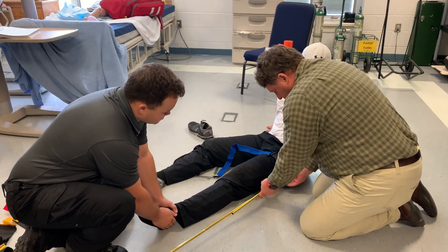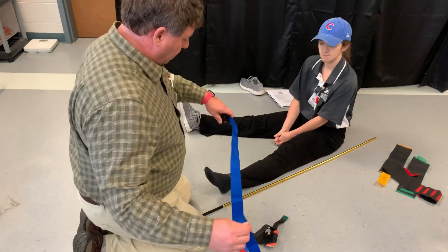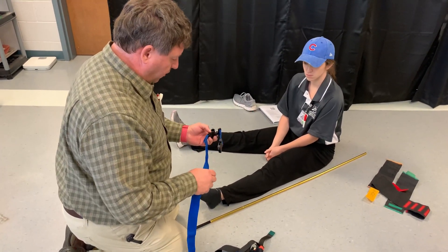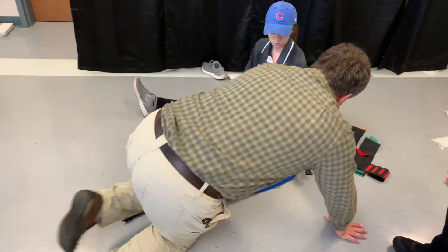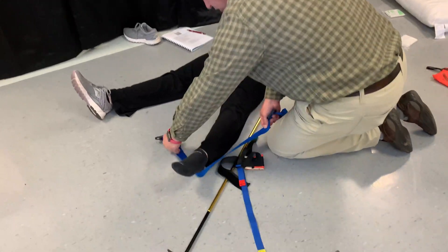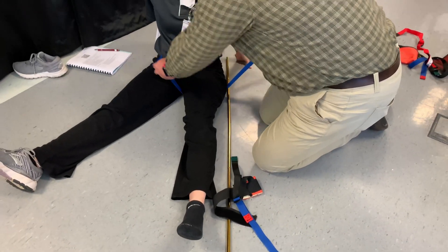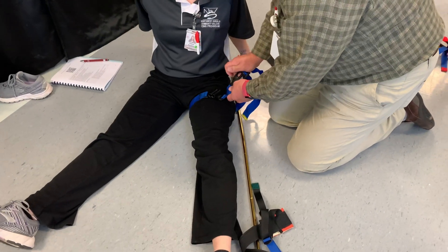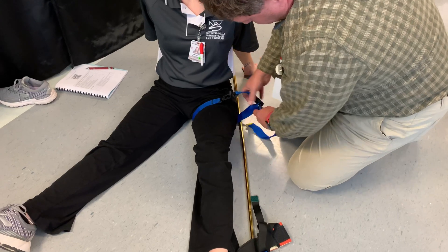The other nice thing about this is you can adjust it on the fly — it's a traction device, a little bit simpler and easier to use. And this is going to be on the outside, where I want the splint to be, so that's going to be on the outside of the leg.